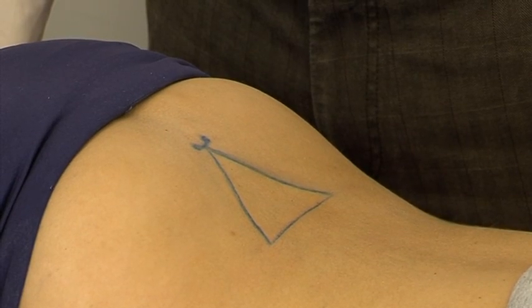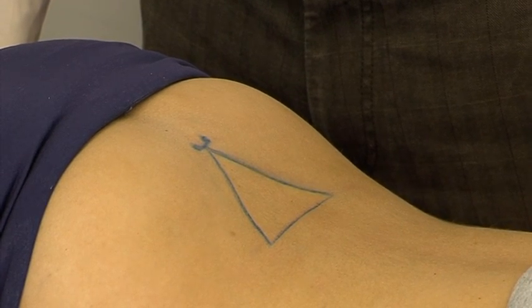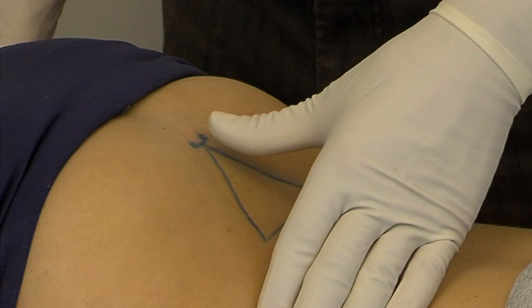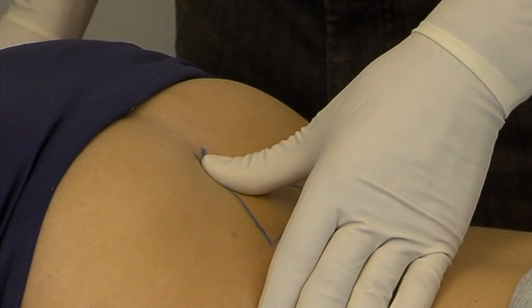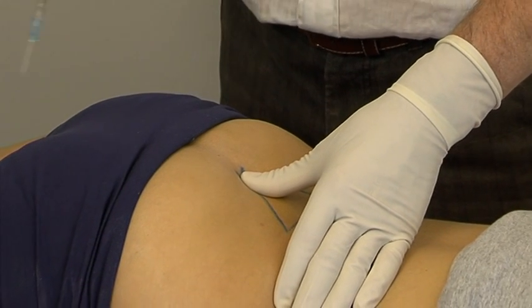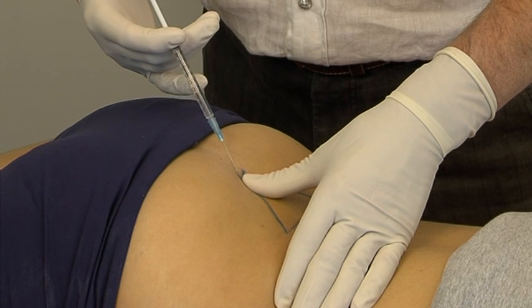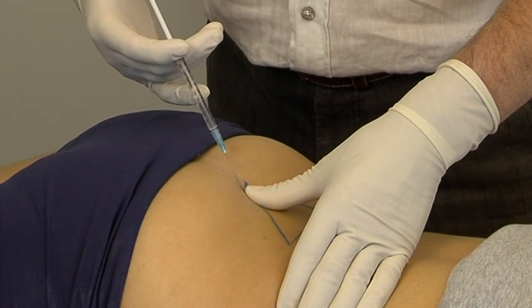Superficial local anesthesia is applied. If much hair is present, the lower sacrum is shaved. The physician stands on the patient's left side, his left thumb on the hiatus between the two cornua. After local disinfection with isopropanol 70 degrees, the skin and the subcutaneous tissue over the hiatus are rendered anesthetic.